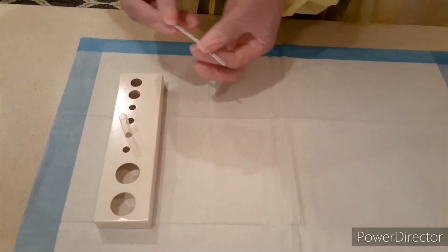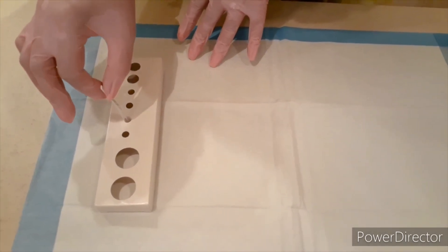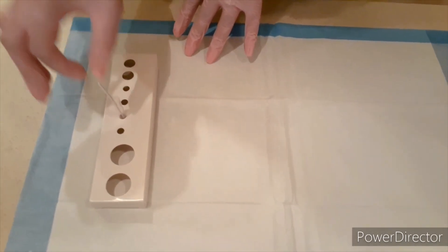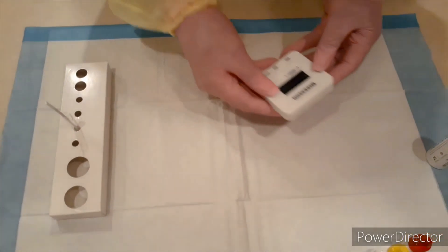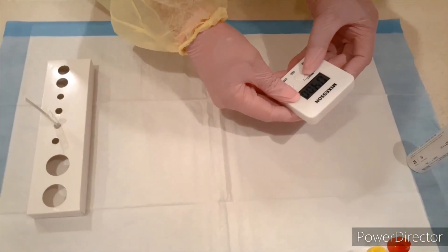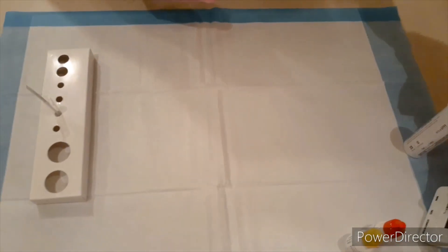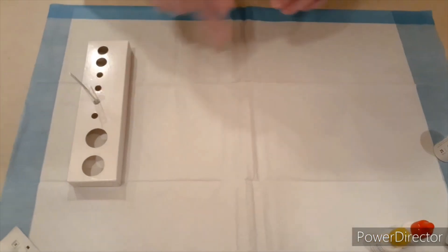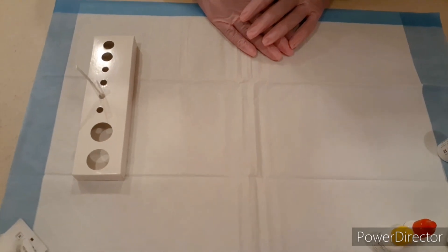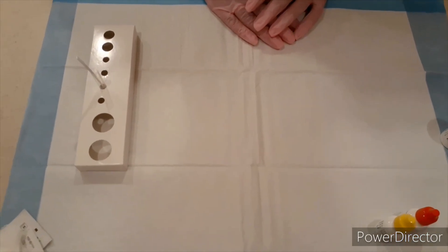These arrows point down, so we're going to sit this down into our sample that we took, and in five minutes it will let us know. In five minutes, our alarm will go off and it will let us know whether or not our patient is positive or negative. We will be back in five minutes.